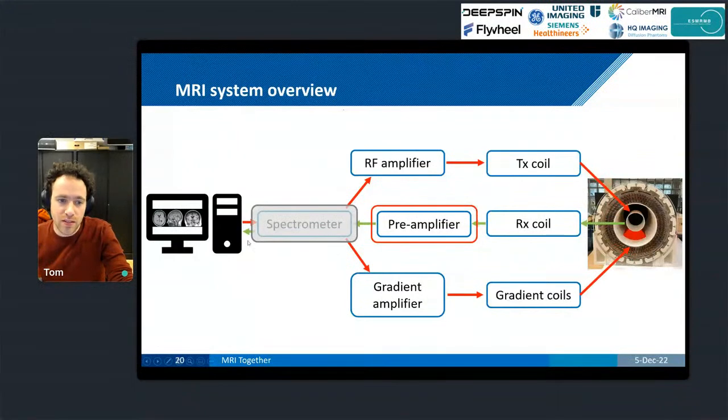And I'm putting this in gray because I'm about to show some images, but because of component shortages, we took our DAC board to Uganda with us to build a system there. But we've had to leave it there, and we've not been able to replace the DAC board. So at the moment, we're imaging with a closed source spectrometer.